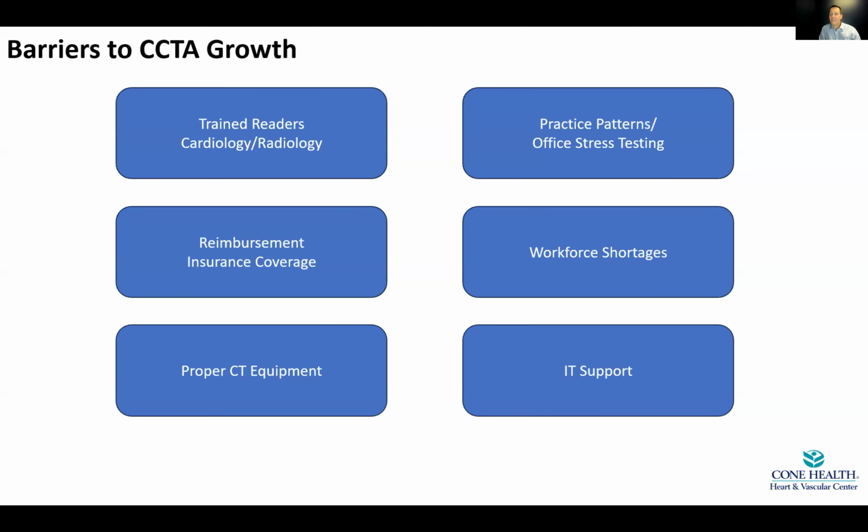And then lastly, IT support is paramount. These are high volume data sets that go to your PACS. You're going to use advanced visualization software. You're going to use several AI technologies we discussed here, plaque analysis and FFRCT, and you're going to have to be able to incorporate them into your practice. So it's a huge lift to do all this, but it is doable.